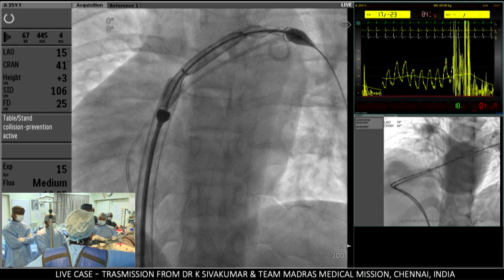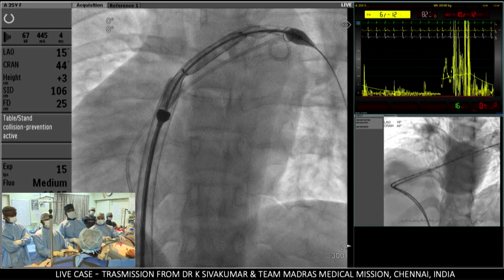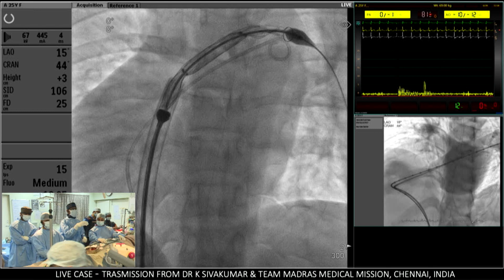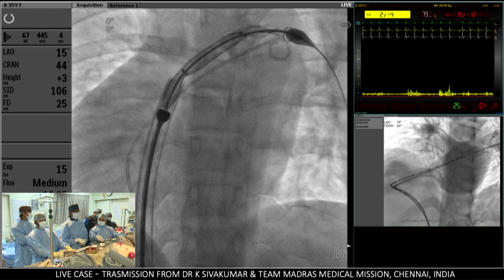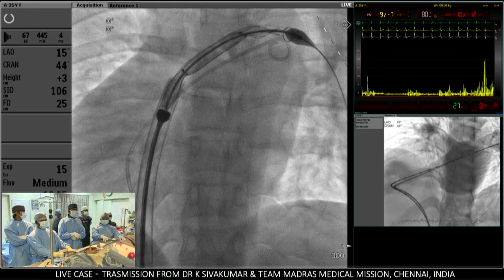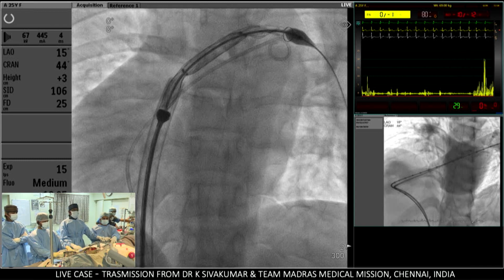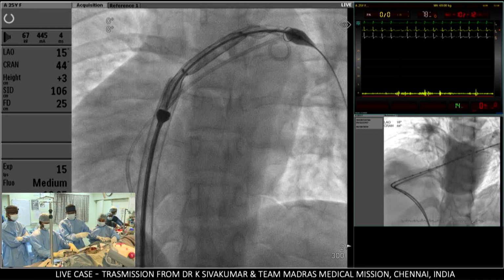In fact, our plan is to put the proximal platinum markers of the valve at the ventriculopulmonary junction, and keep the majority of the valve in the dilated main pulmonary artery and form the flare on the confluence. Actually, if you look at the image, the pulmonary artery is very huge. It measures about 48 millimeters on the CT scan. However, it is very expansile.